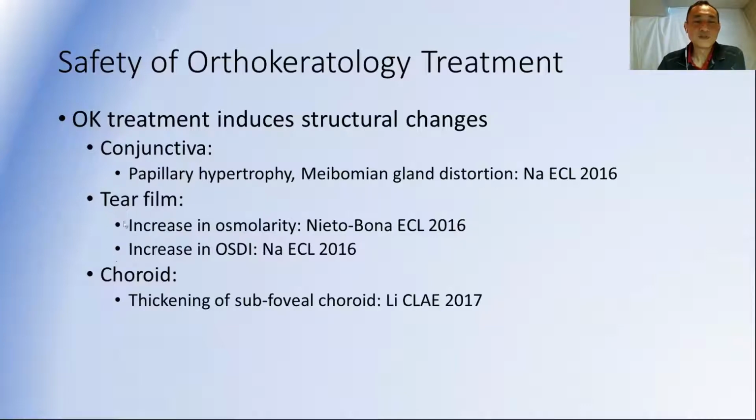In terms of tear film, we do see some changes in tear film quality, and that may cause some problems for patients over time. And in the choroid, presumably due to issues related to myopia control, we see some changes in the subfoveal choroid.